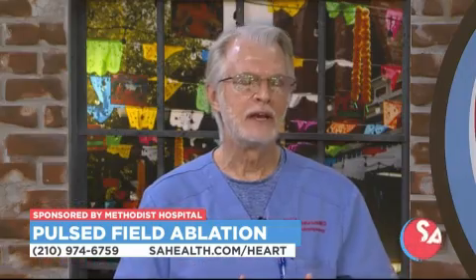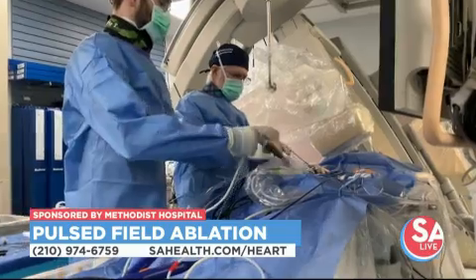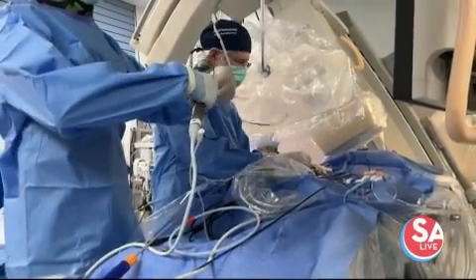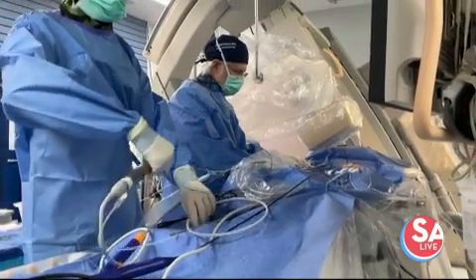And so is that part of how it's beneficial to patients? Right. The beneficial effect is, a couple of things. I think the main thing is it's safer. I think the procedure we've been doing for years is safe, but there are still some rare complications, and they're related to that thermal damage of the surrounding tissues, either the pericardium around the heart or the blood vessels or arteries or esophagus or those tissues. And with this, we can target just what we want. It's also faster. We can do the procedure in half the time, so patients are under anesthesia less time. And most of them go home same day now.